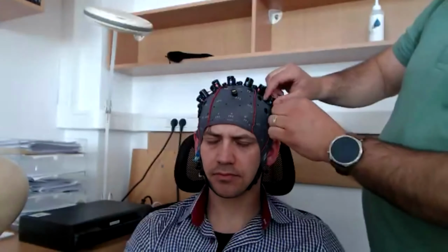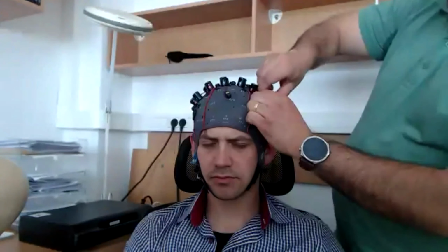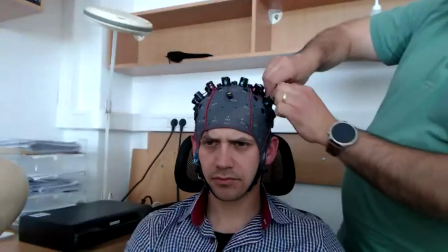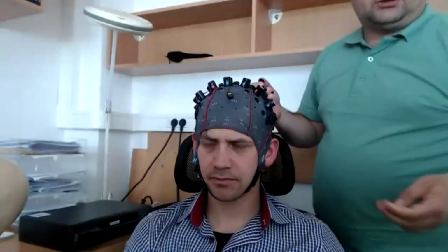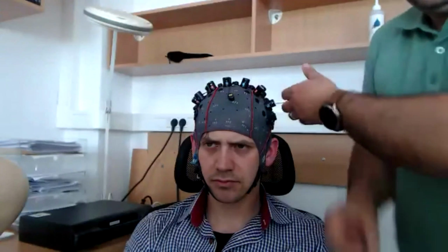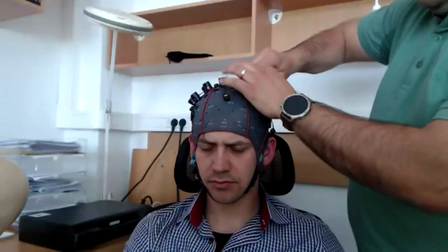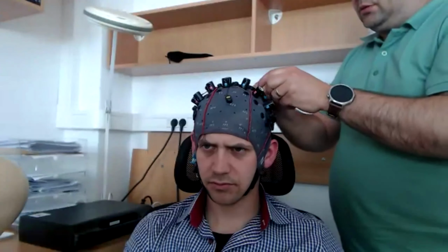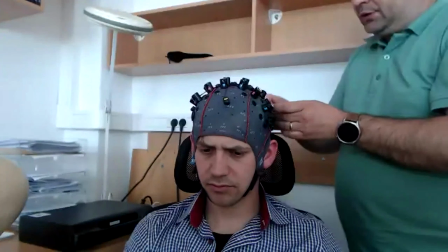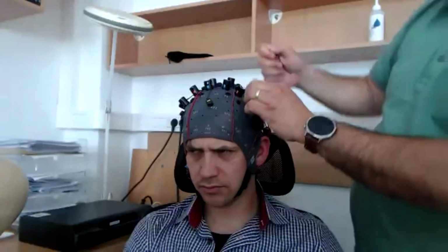But yeah, after, let's say that we perform the full experiment, now I do have to put everything down. So it's very easy. First, as I showed you earlier, just remove the clips nicely so they won't get gel on them. Put them all on the table. As soon as I'm removing an optode, I'm putting it in the back where there's no EEG gel.